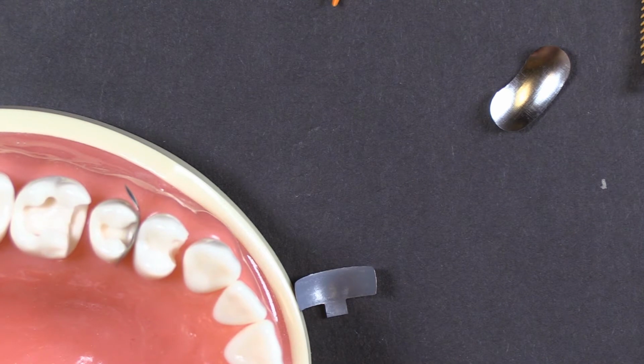So the next most common question that was asked was, what do I do about situations where the ring is popping off? Maybe it's a pedodontic application where you've got really short teeth. It's tougher to grip those little guys. Or you're on a first molar, doing an MO on a first molar, and there's not much of that tooth erupted.